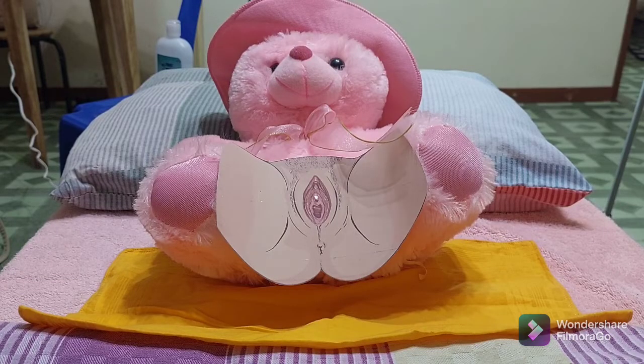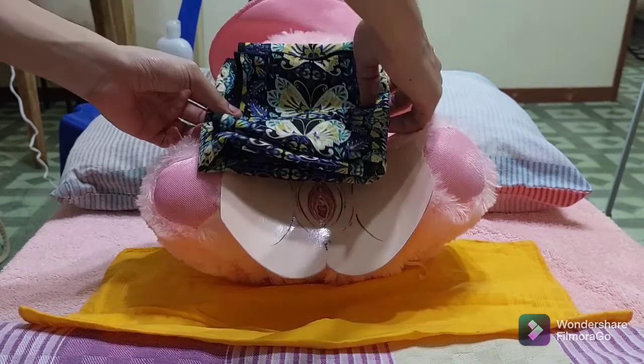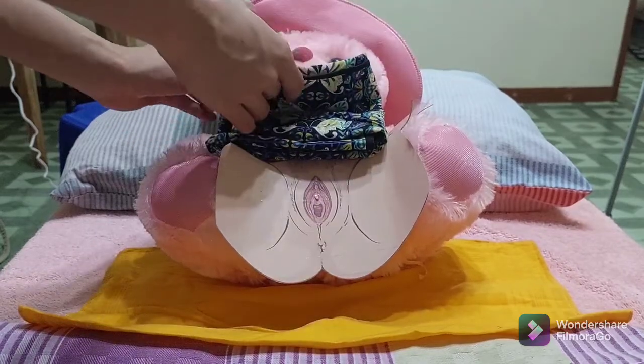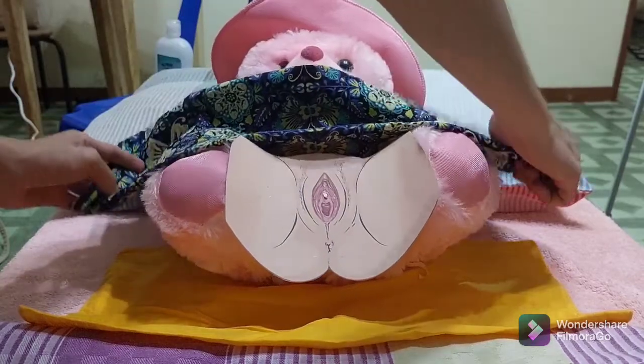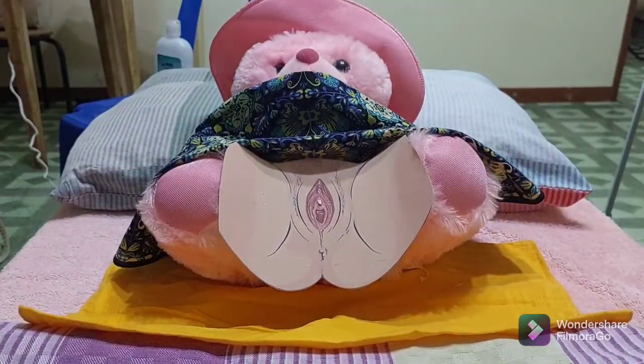Now place a blanket or sheet to cover the patient and expose only required anatomical areas. These steps protect our patient's dignity and privacy. Then apply clean gloves and wash the perineal area with warm water and soap, or perineal care according to agency policy, because cleaning removes any secretions, urine and feces, and reduces the risk of catheter-associated urinary tract infection.